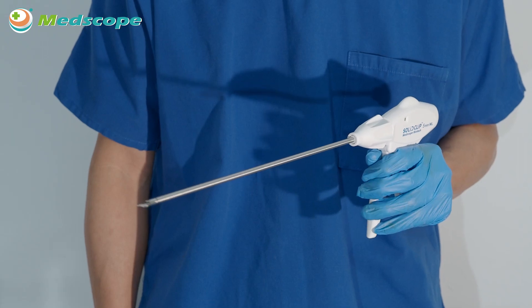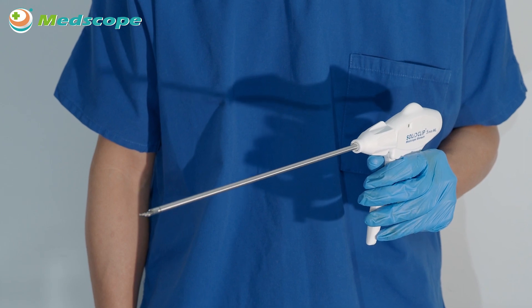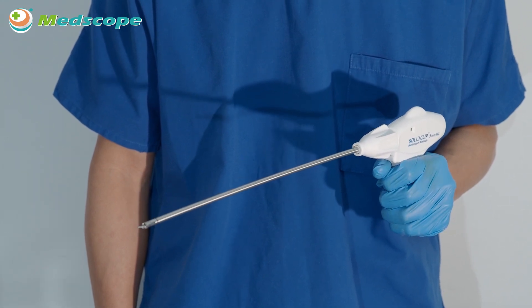Advantage 1: Smooth ligating force provides excellent operating experiences. Ergonomic handle design provides optimized control during clip loading and closure.